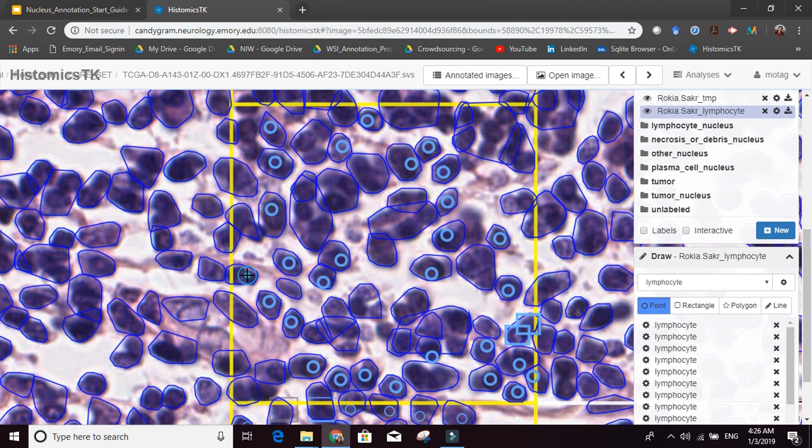I think these are okay. This one is also correct. This one is correct, but it's kind of tricky, so I can't really place the dot anywhere. But I can put it here, which kind of just shows this part of the nucleus. This one is correct. This one, I think this is a lymphocyte. Yeah, that works. This one is correct. This one, nope. This one is correct, no problem. Okay, so you can see that all of the lymphocytes where the algorithm was actually correct in labeling, I got them.